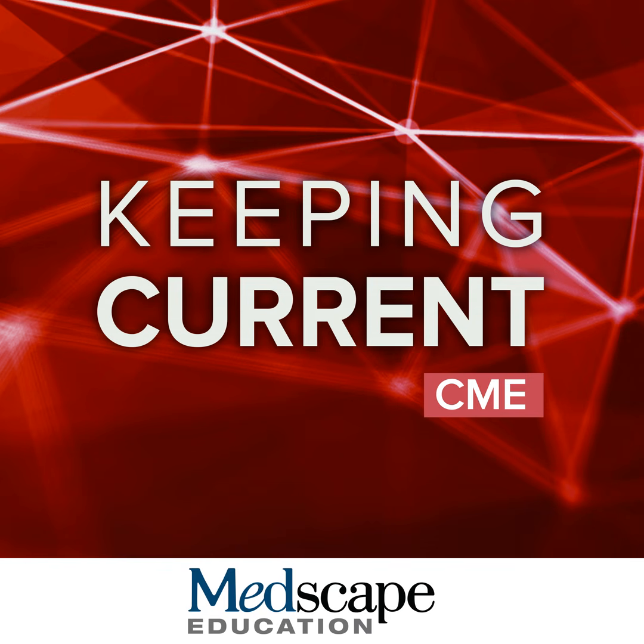And so we have a different type of PET scan that we can do for this. And in the United States, flortaucipir is FDA cleared for tau PET. And here's the example of a negative and a positive tau PET scan. Negative scan, in this case, very washed out. And a positive PET scan, this is an example of someone with a lot of uptake in the temporal lobes on both sides. And you can see that positive stain as it comes together.